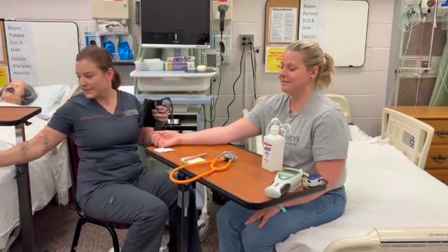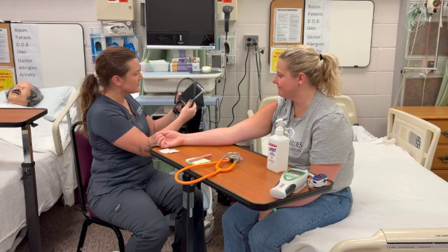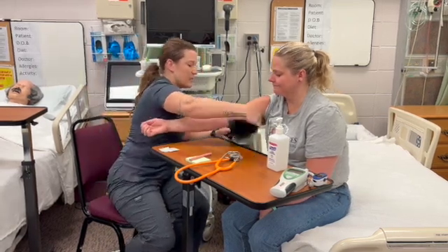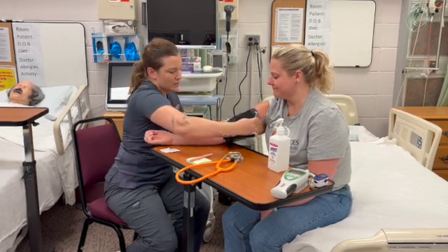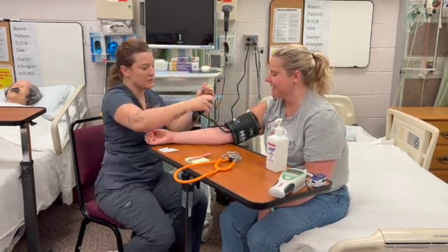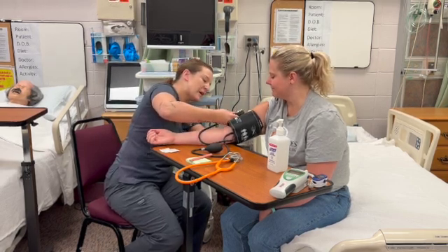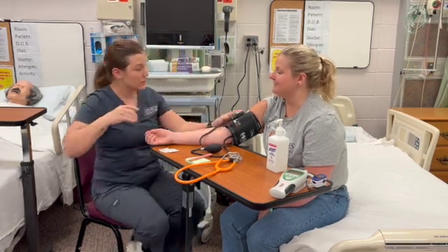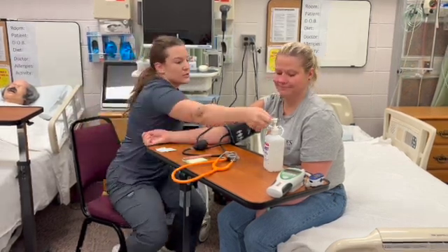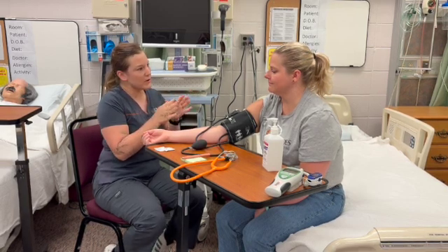I'm comfortable with you not using gloves. Great. So first I want to make sure that your cuff is the correct size for you — it looks like it is. I'm going to wrap this around your upper arm here and line it up with your artery. Let's make sure it's not too snug or too tight. Is that comfortable for you? Yes. What does your normal baseline blood pressure run? 120 over 80. Oh, that's great blood pressure.